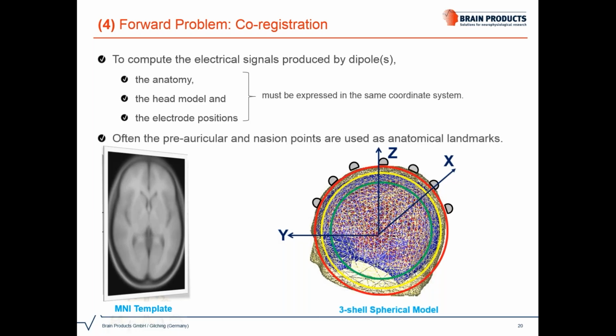So the most commonly used external fiducial markers or internal anatomical landmarks to define the coordinate system are the nasion point, describing the y-axis, which is the posterior-anterior direction, and the right and left preauricular points, describing the x-axis. The intersection of these 2 axes makes the origin, and the z-axis basically points towards the tip of the head, forming right angles with the x and y-axis.